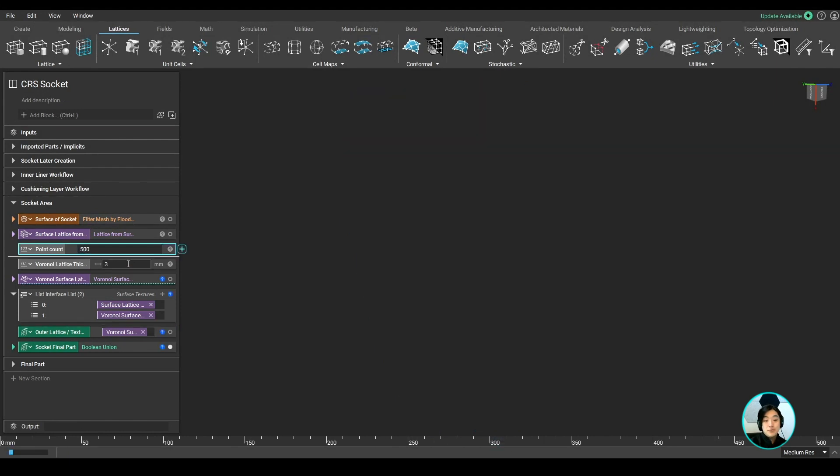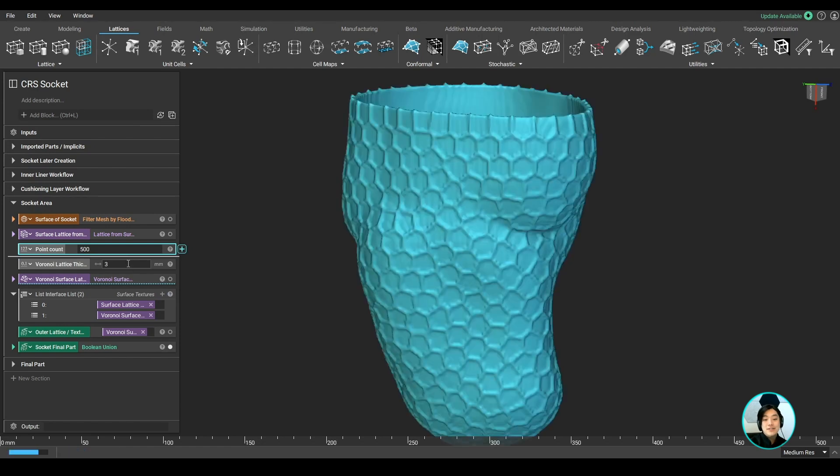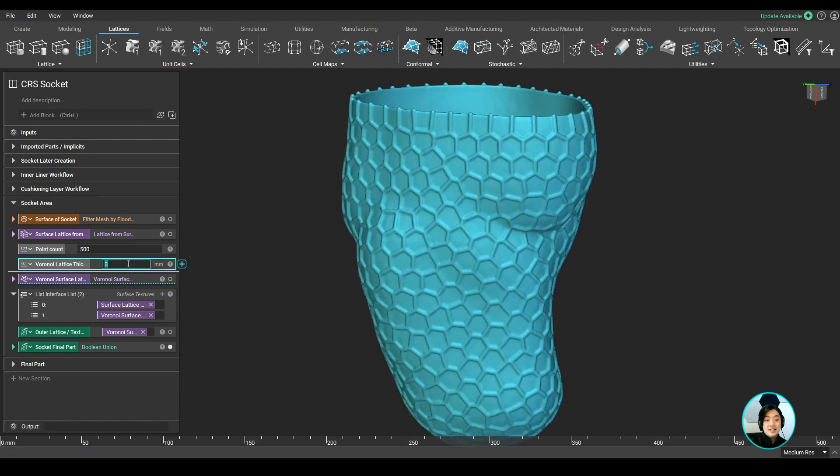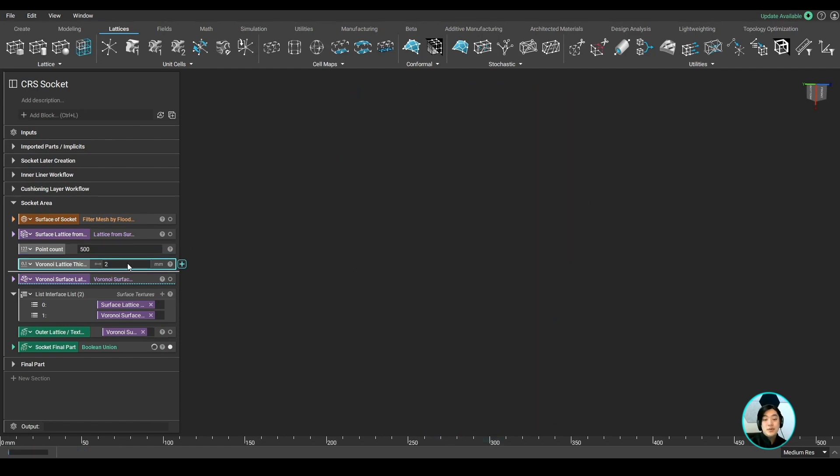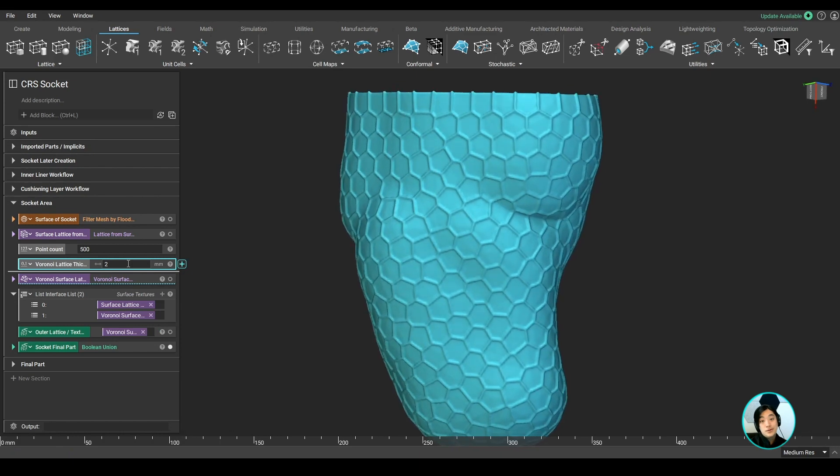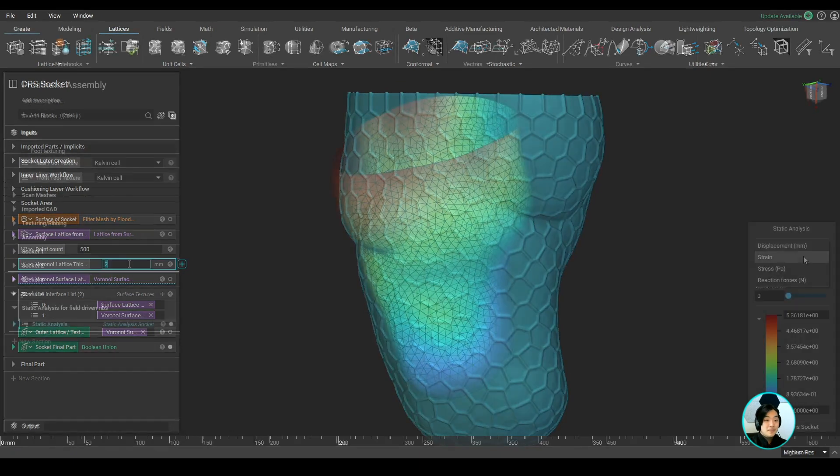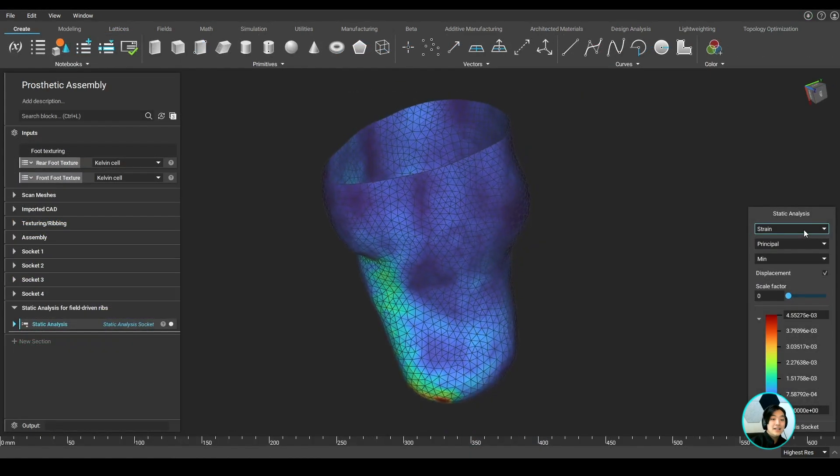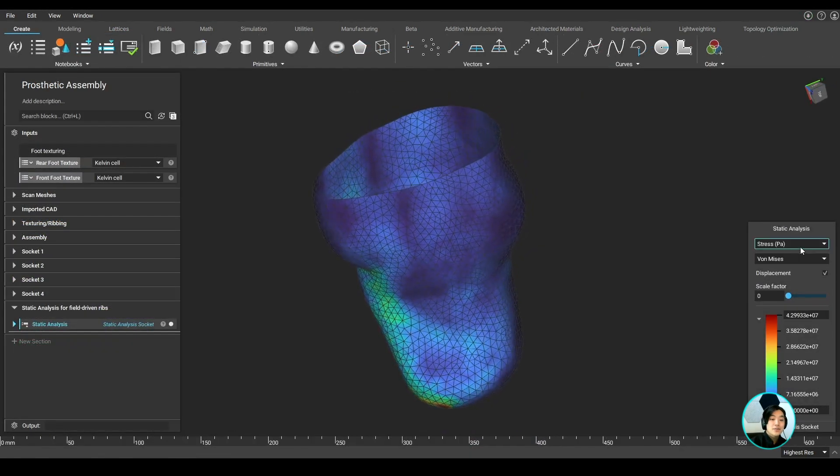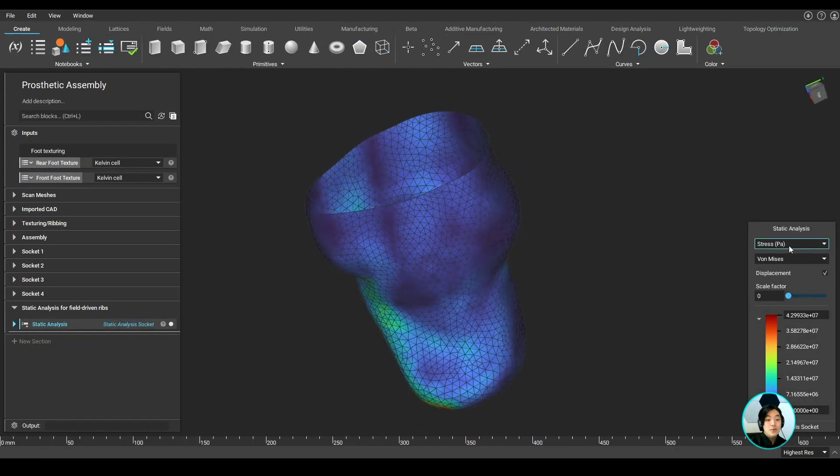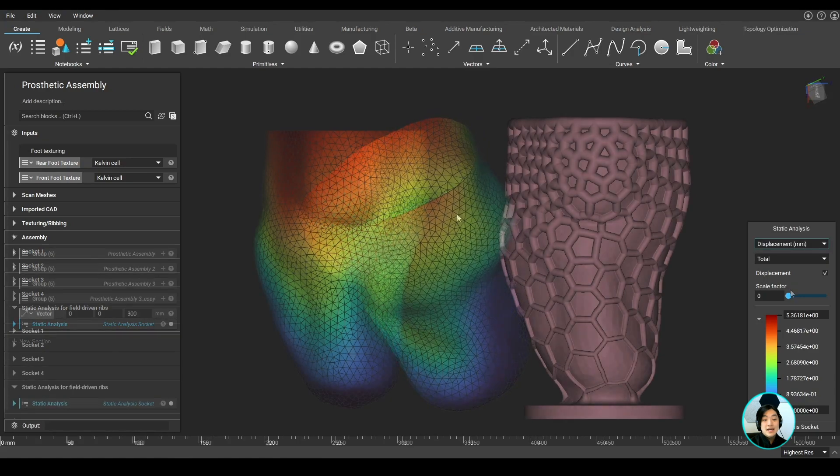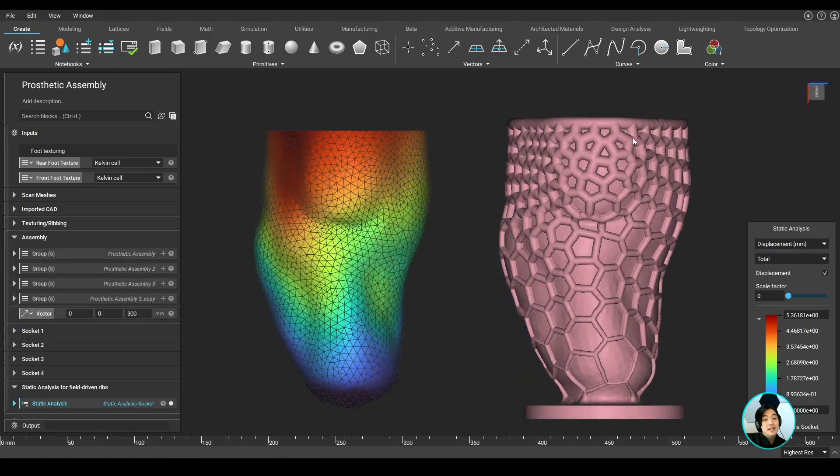Aesthetics play a role for sure, but the main goal here is to provide adequate support to the areas that need it while reducing the weight of the socket to make it more ergonomic. We can thicken lattices in areas with high stress or displacement and have them thinner in low stress or displacement areas.